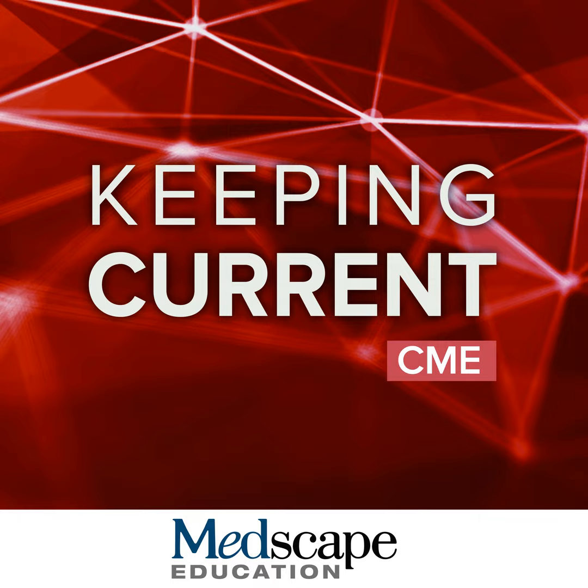There are also some emergent uses for gadoxetate. We can use it for abbreviated MRI for screening, and there's also the functional liver imaging score, which can predict decompensation and mortality.